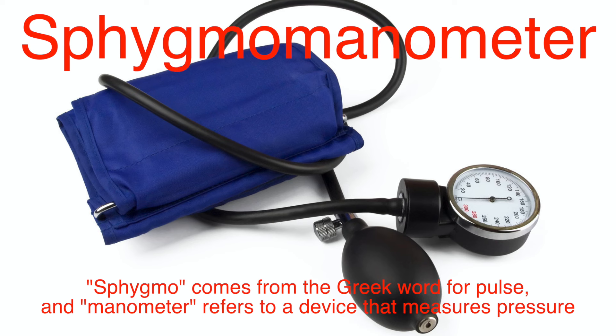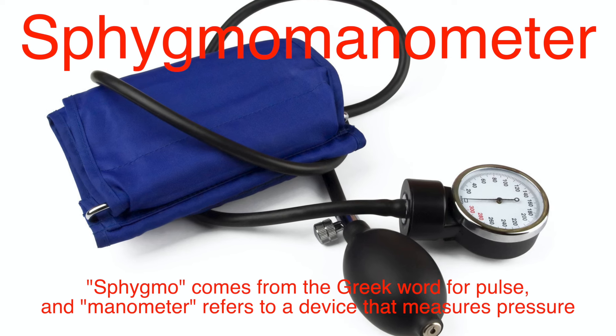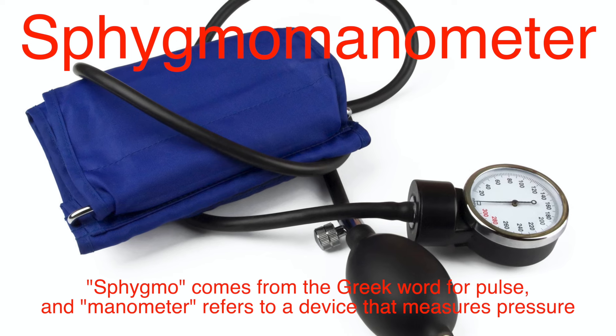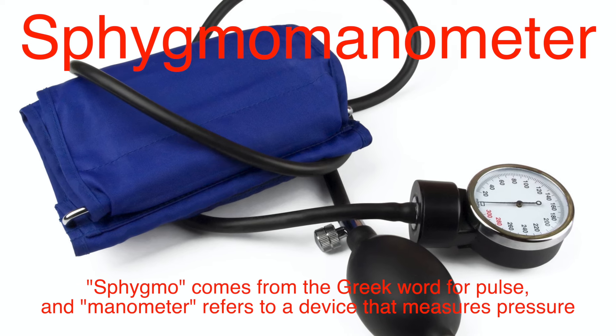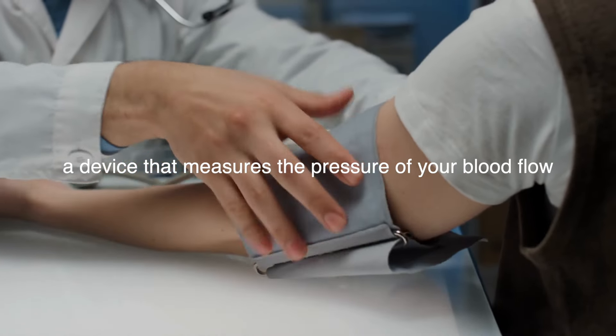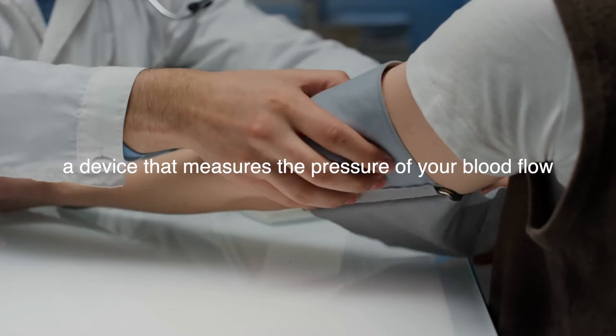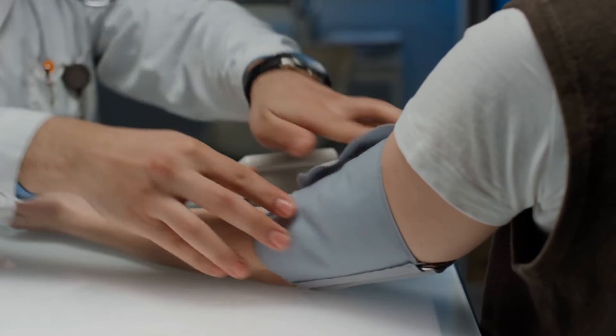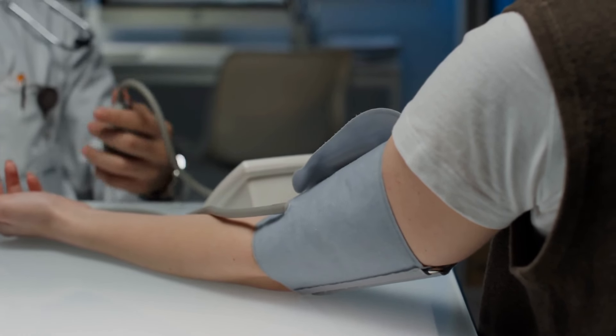First things first, let's break down the term itself. Sphygmo comes from the Greek word for pulse, and manometer refers to a device that measures pressure. Put it together, and you have a device that measures the pressure of your blood flow. It's what doctors and nurses use to check your blood pressure, which is a crucial indicator of your overall health.